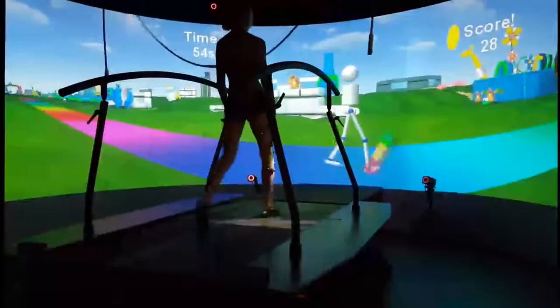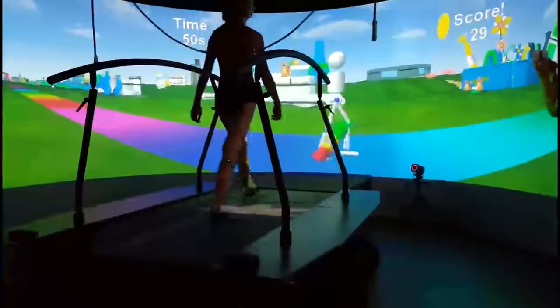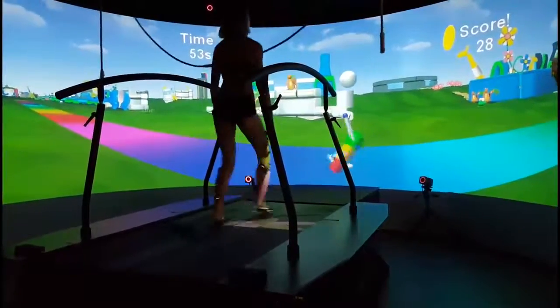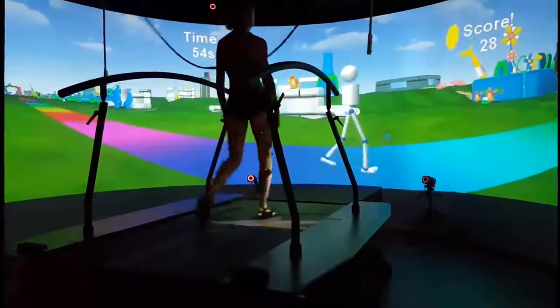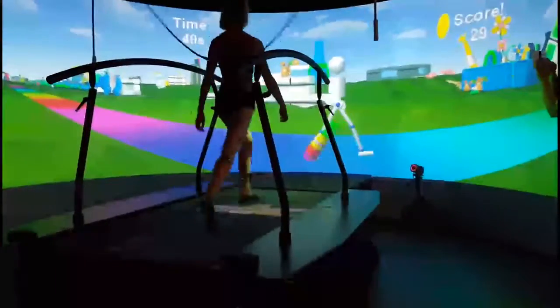So here you'll see what that looks like. The cylinder that's drawn on top of the ankle on the right side will show red, yellow, and green, and then the blue bar is actually how strong you did your push-off. And when the blue bar reaches up into the green, you know you're doing well.